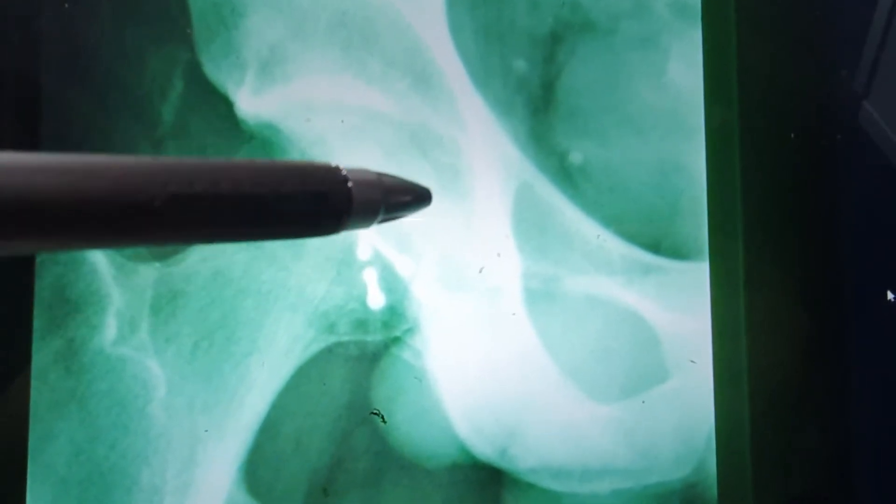This is a 28-year-old male who had a fracture involving the femoral head. You can see the screws here — he's had it fixed.